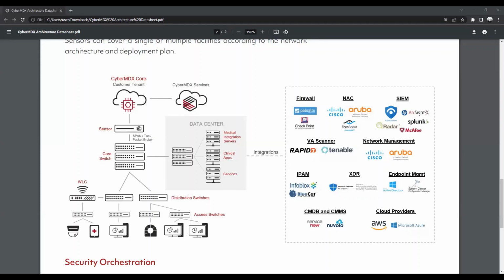Valerie, how many protocol types are there at the moment for each part, like IoT, OT, medical, Internet of Things devices? I understand that Forescout alone could detect something around 150 different kinds of protocols with this DPI. How many different kinds of protocols does CyberMDX provide for the Forescout platform?